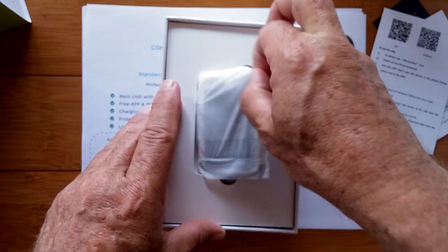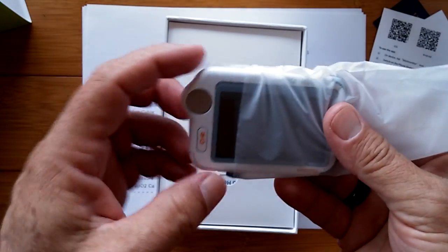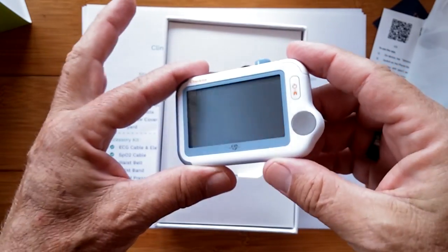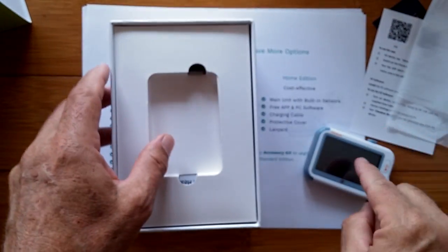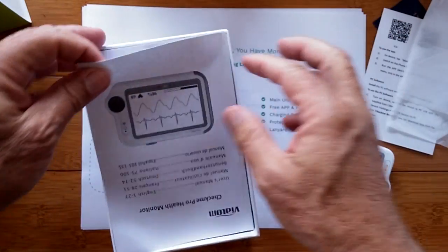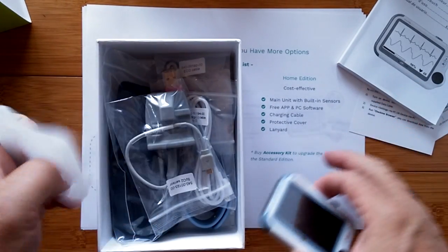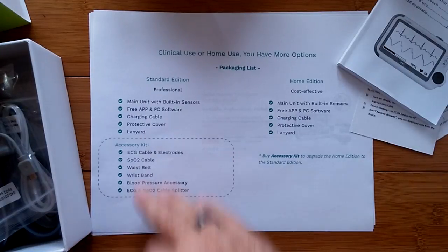Inside the bag is the actual unit itself. It's similar to a pulse bit device we've seen before, but this one does many more things beyond just ECG. There's also a huge booklet included. The components differ between editions — some are for the home edition and some for the expanded standard edition. You get a protective cover with the home edition along with the main unit.